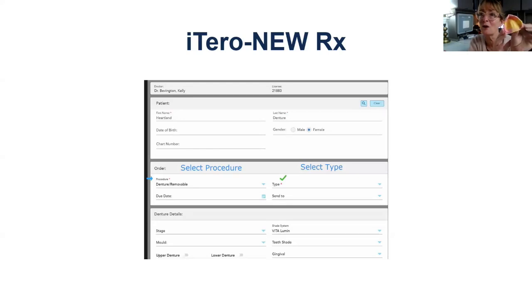So mine is yellow and pink. I don't necessarily recommend yellow and pink. I have used blues and greens as far as a color, and it seems to pick up faster. It seems to pick up and stitch together better. Now, again, iTero's research and development says color is not an issue with iTero, that it's topography. It's the lumps and bumps. So it's patient specific as well. And then, yes, soft on the final. So the soft flanges, I think, is what you're talking about. I have my note here.